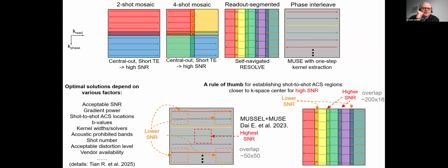Hi, Ryan, may I ask a question? Maybe Frank. Hello. Yes. Hello, Rai. First, sorry to everybody. I'm joining because of interest in Rai's work. I'm not a Pulseq expert at all. But Rai, I can more or less understand how it works with readout segmenting when you have ACS lines measured at the same time.